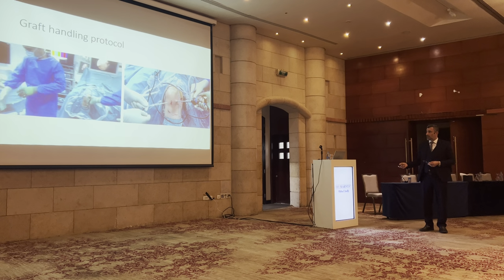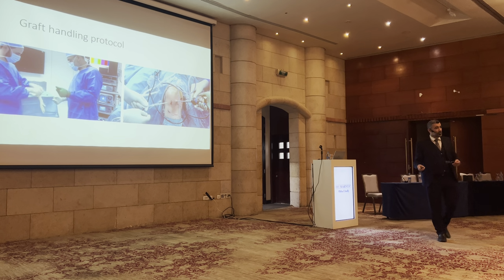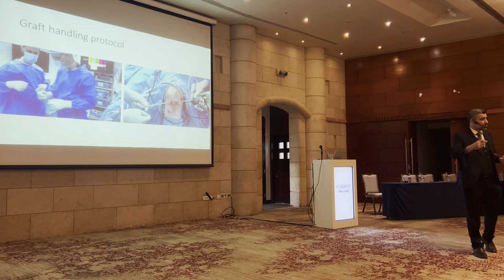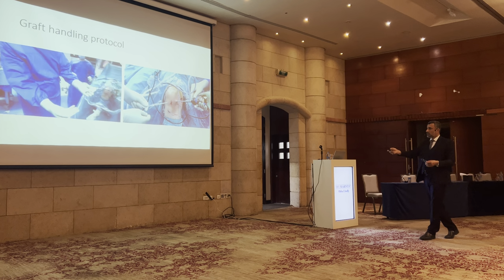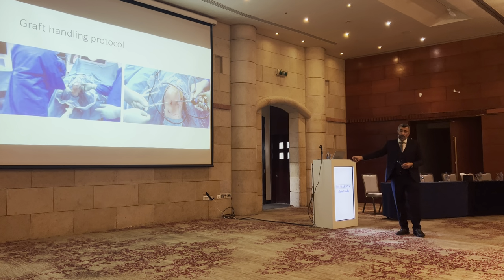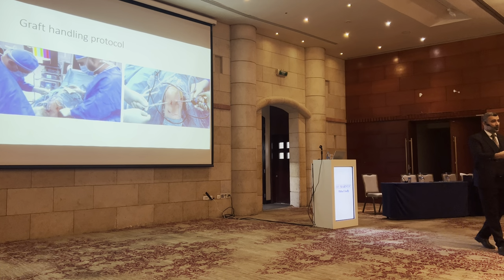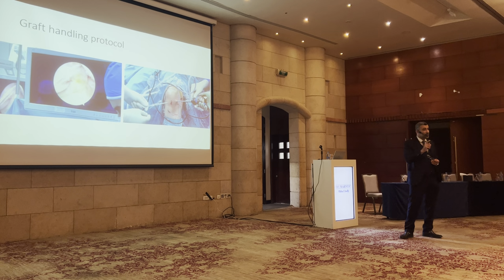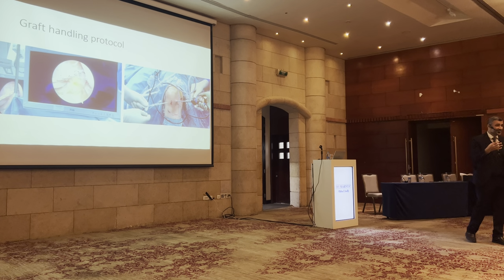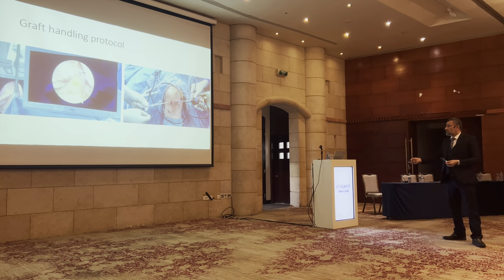Now, graft handling protocol. We have a protocol, no one touches the graft. We give it to one person always who does the preparation of the graft. He didn't touch anything before. He puts the graft in this antibiotic solution. And then when I finish preparation and go to take it, I change the gloves. And even the way I put on gloves, the nurse will not touch the fingers. You see? And even I don't touch the ground, I touch only the gloves. So this is very important.